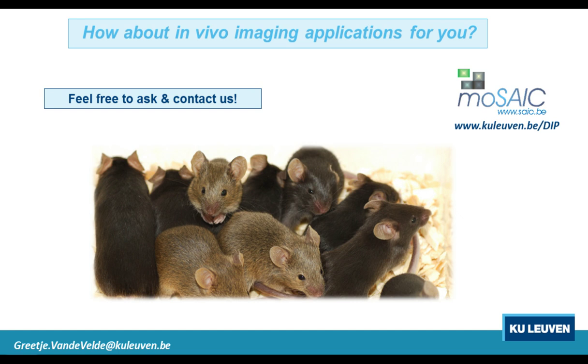much used application. You can also use it to do cardiac imaging and cardiac functional imaging. That also works very well, but there you do need to work with a contrast agent. But these are all commercially available, and you can combine that with the whole body scan. So we combine it with a pulmonary scan, so we do that in one go. Other things is that we've been looking at the bladder with microCT by filling the bladder with a contrast agent. We've also been looking at bowel infections. Well, you can always browse and Google, and there are more and more things coming up.